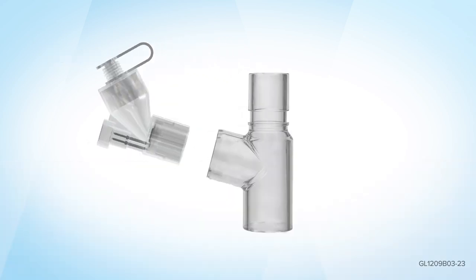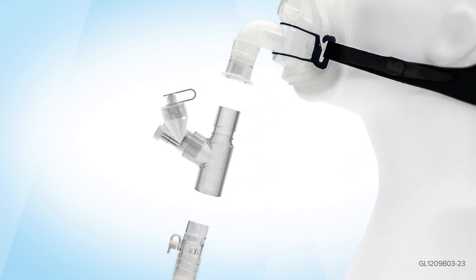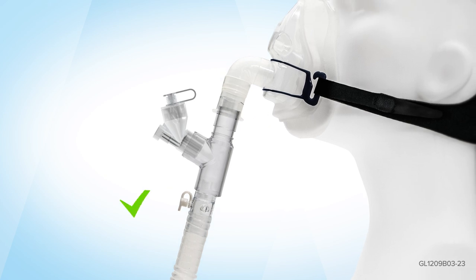Place the Aerogen Solo firmly into the Aerogen 22 millimeter tee piece and ensure correct orientation. Insert the Aerogen Solo and the Aerogen tee piece between the mask and the exhalation port of the single limb NIV circuit using a non-vented mask.